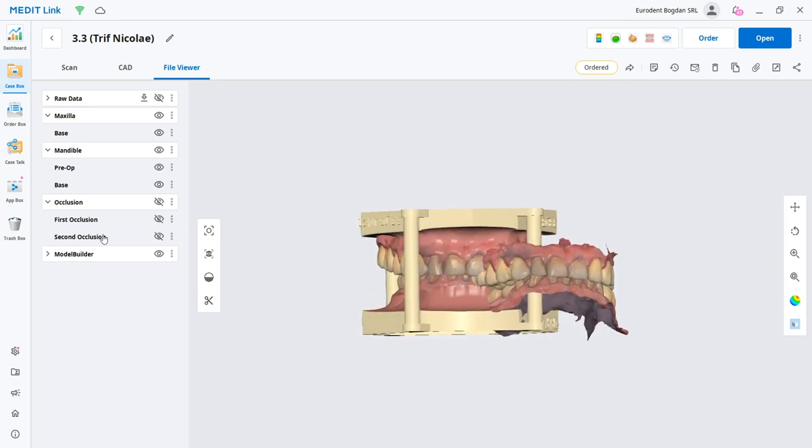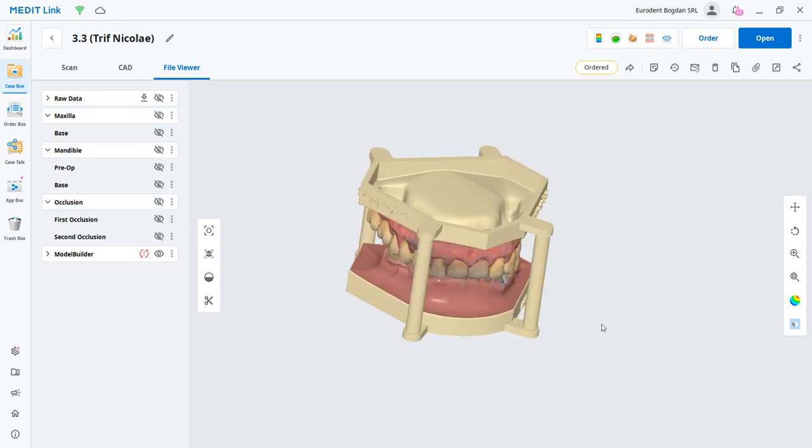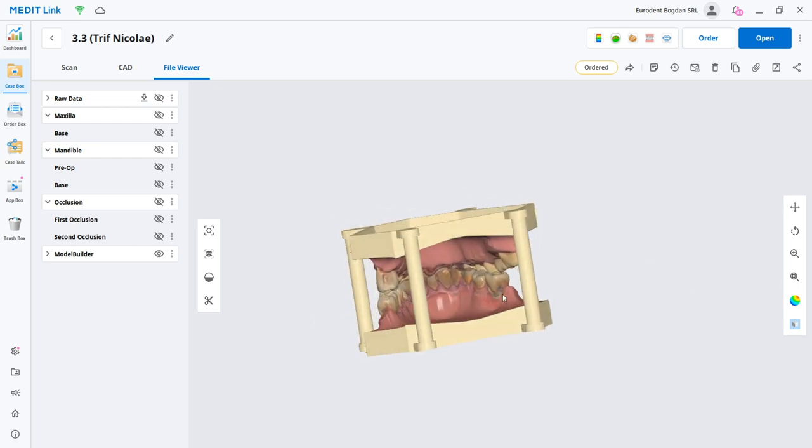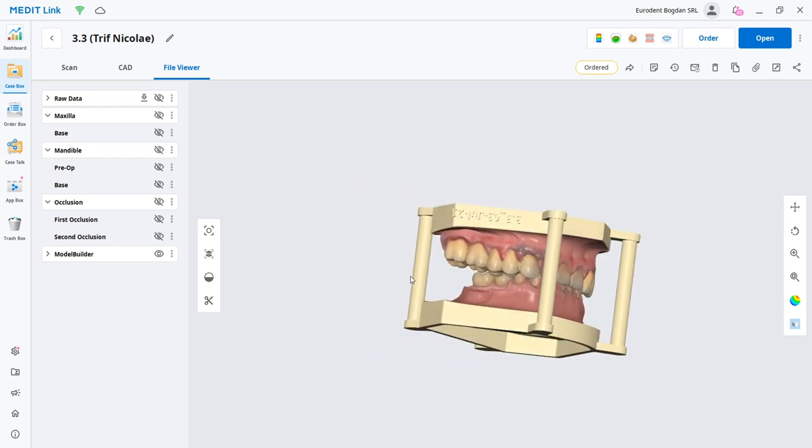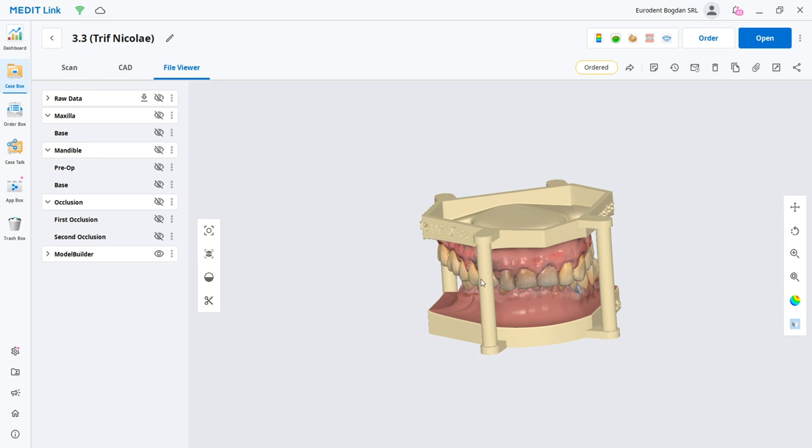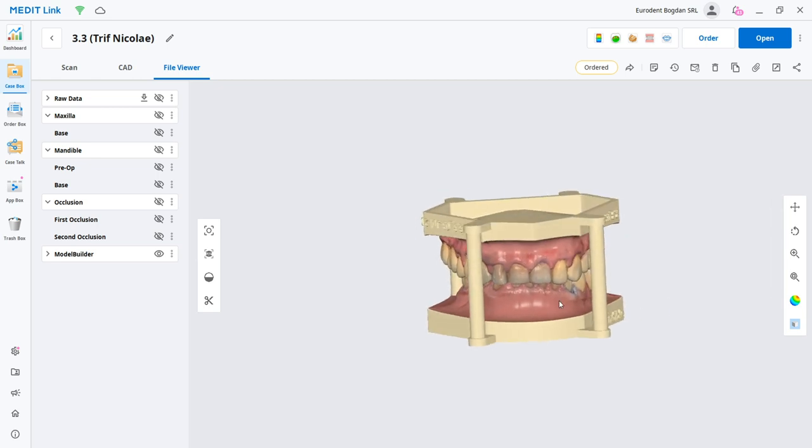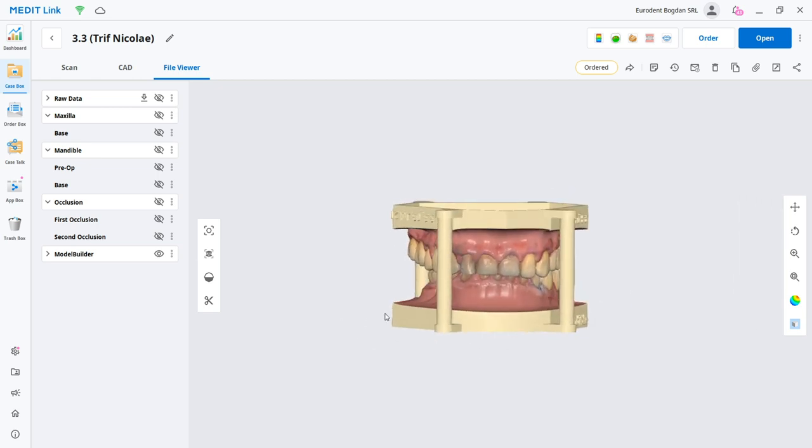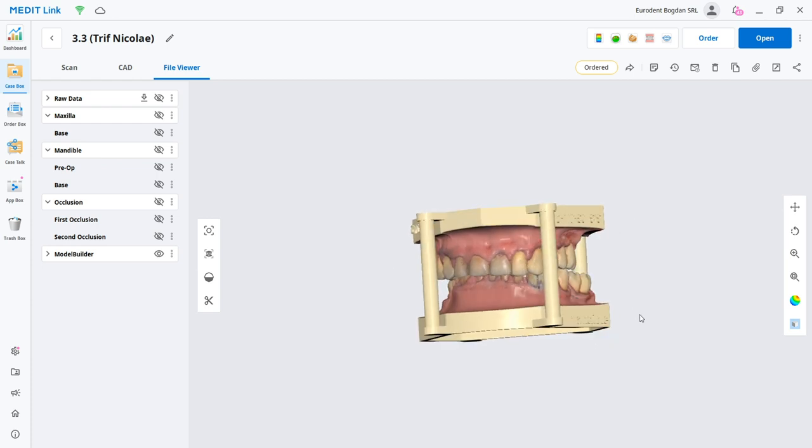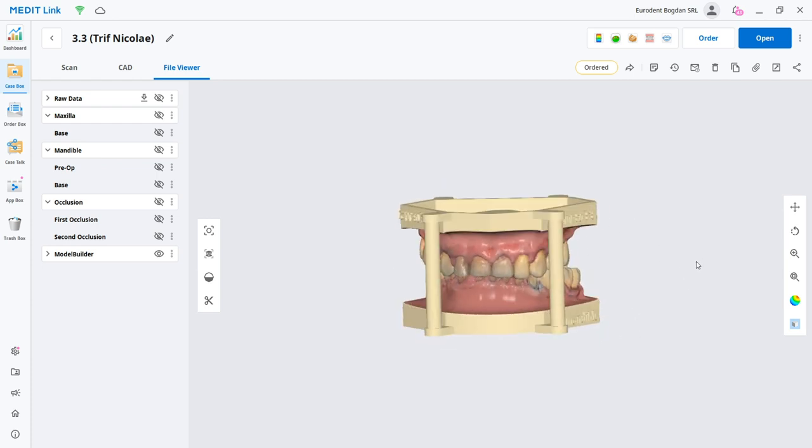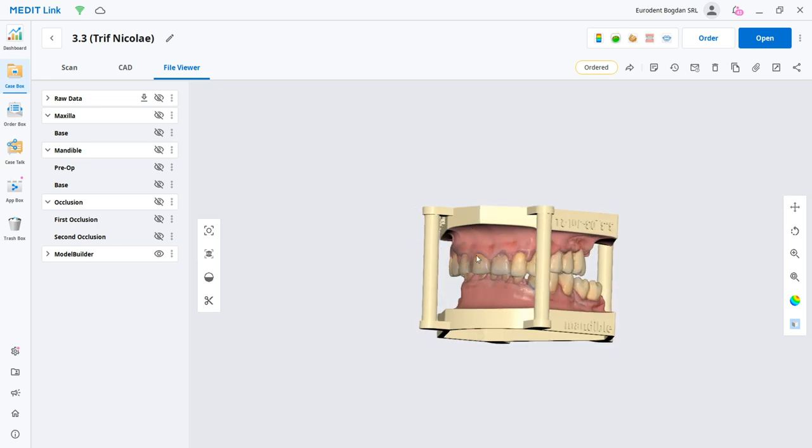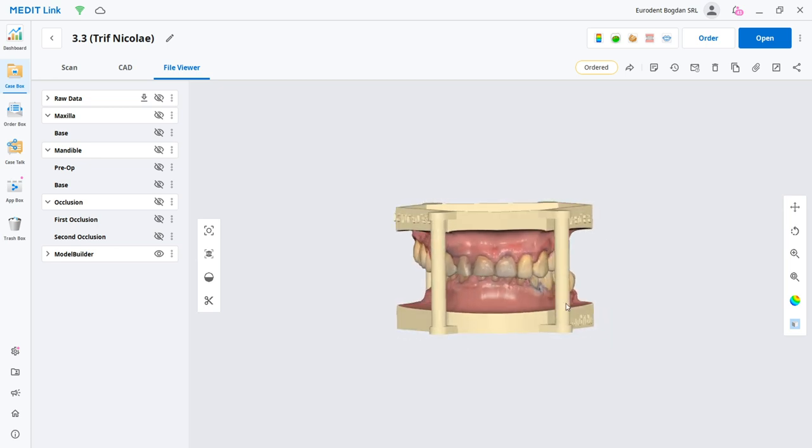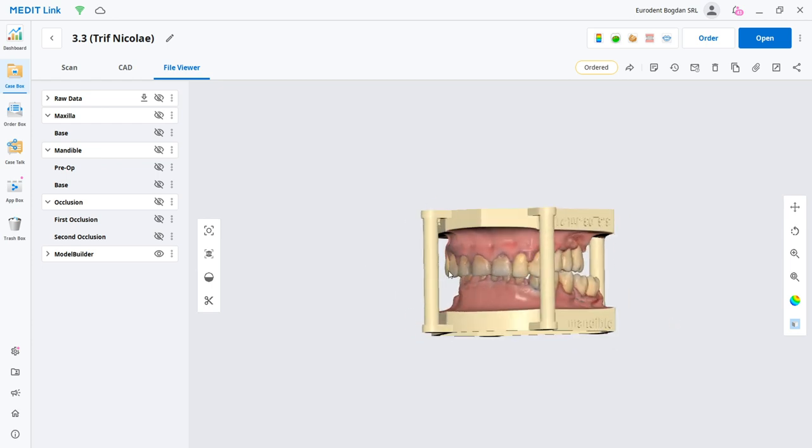Here you can see the model. Let's just deselect the scans and here it is, our final work. What I can tell you is that in the future we'll have many more functions. For sure we're going to be able to cut gingiva and to separate gingiva to do models for implants.